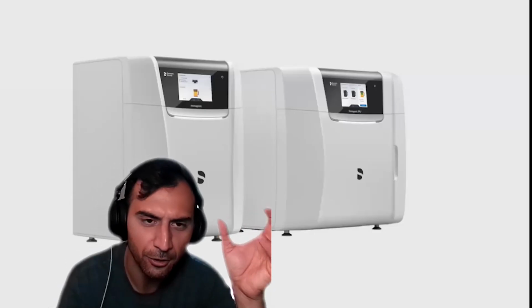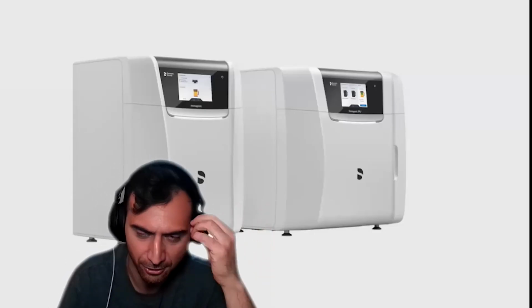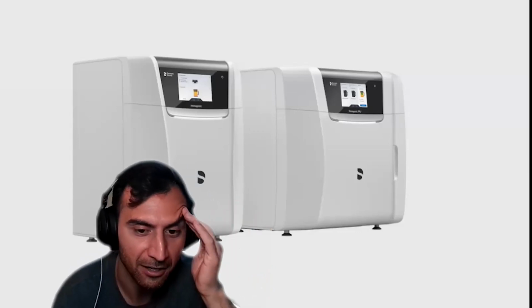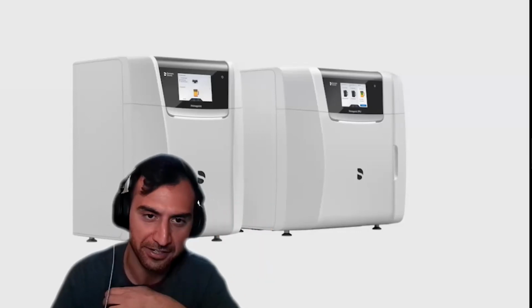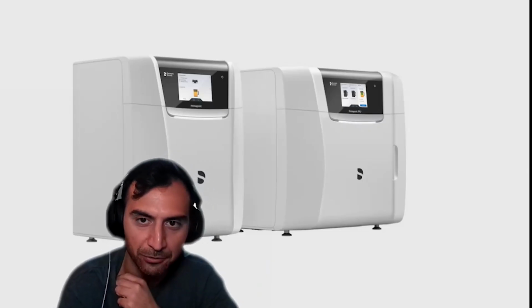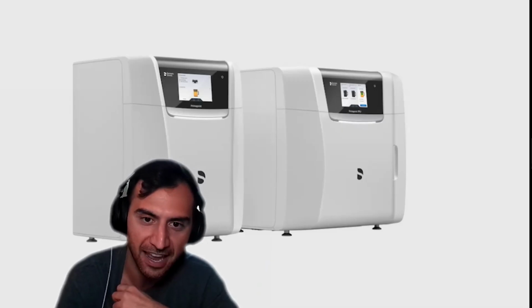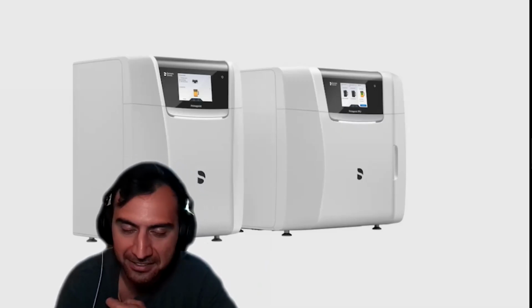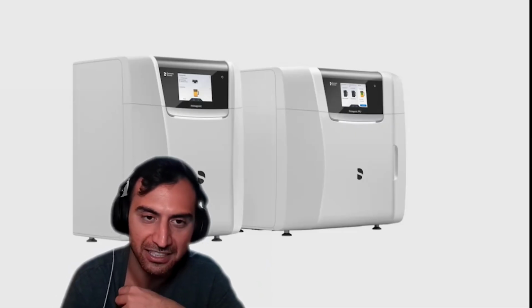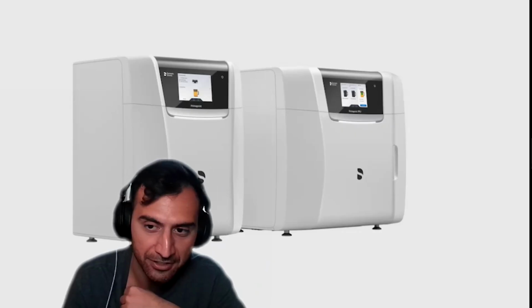There's also what I'd call dental printers now. This is a newer concept. This one's by Dentsply. It's called the Prime Print. Again, if you're not watching, it looks different. It's got a different build inside of it. The whole purpose of having it built differently is to make it more facilitated for an office staff to use it. It's less messy, basically. It's supposed to be easier as far as your different technologies communicating with it. You can almost work directly from your scanner to get it sent to the printer.